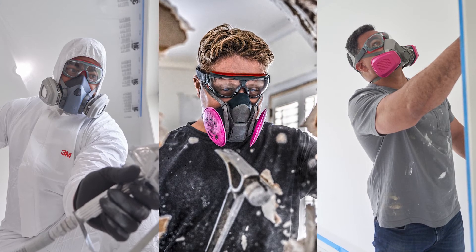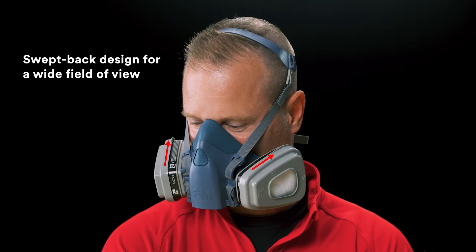One feature that is important to consider is how the respirator cartridges sit on the respirator face piece. The cartridges for 3M respirators like this one have a swept back design that provides a wide field of view.